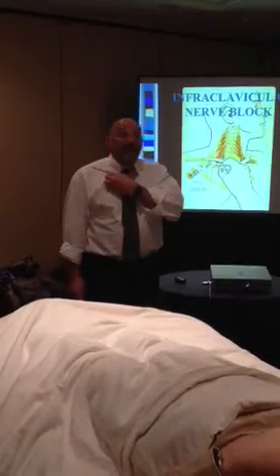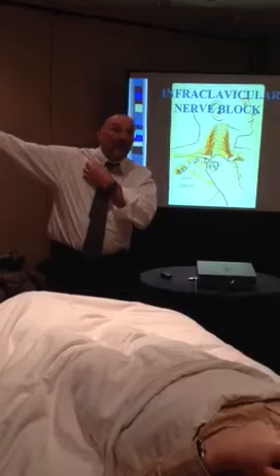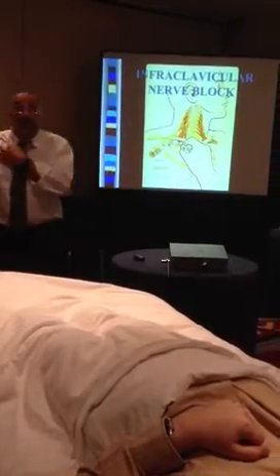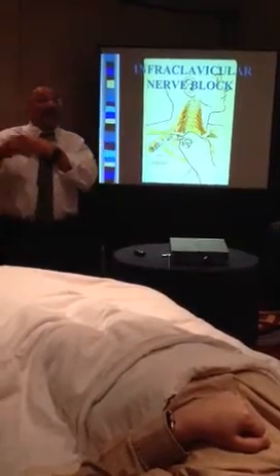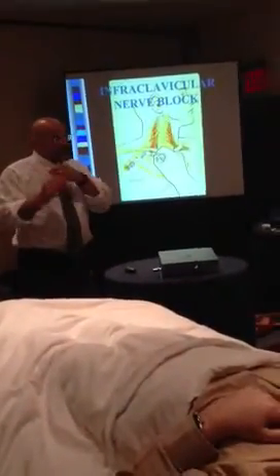When my arm is at my side, my clavicle is fairly horizontal. Okay? As I start to abduct the arm, what happens? It becomes more vertical. As the clavicle becomes more vertical, what does it do? It brings with it the chest wall. As the chest wall comes out lateral, what does it bring with it? The chest wall contents. So if I found my insertion site with my arm at my side, but then I abducted the arm, everything came out lateral except for one thing. My insertion site, it's way too medial. Okay? So that's number one.